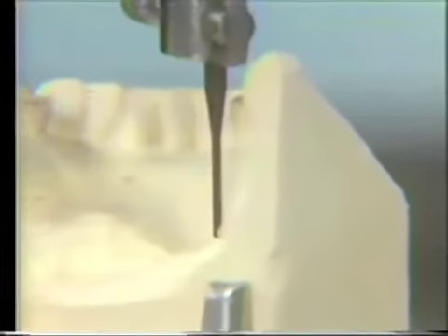Now we're looking at the lingual area apical to the molar abutment tooth, and we see that the height of contour in that area is very low and that there is really no undercut. All the space that we see in the analyzing rod is above the point of contact. So this means that the partial will draw in that area over the soft tissue, if we block out this potential undercut, or if we get rid of that with our restored crown.